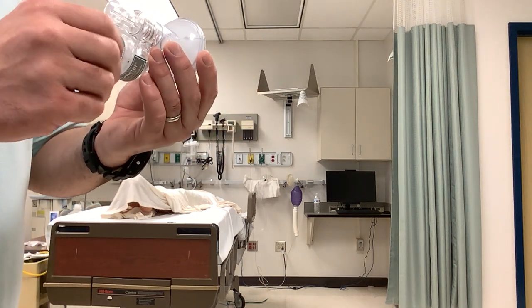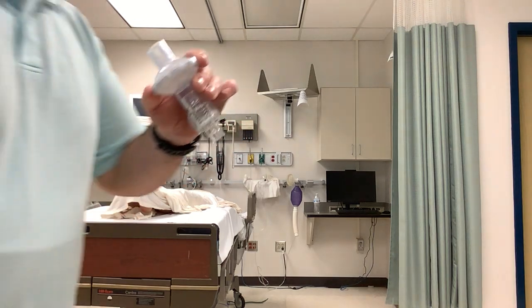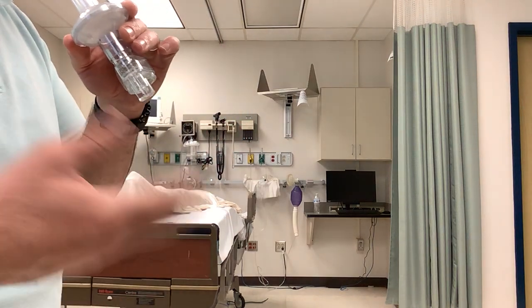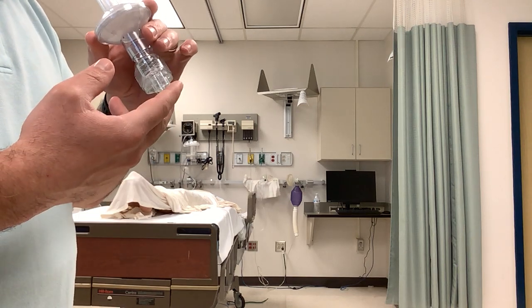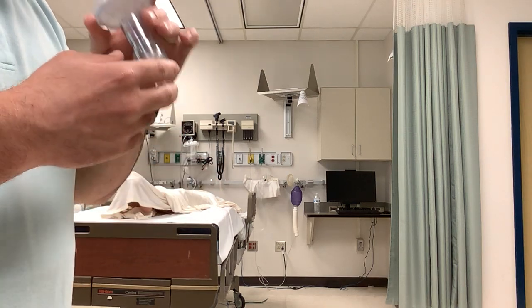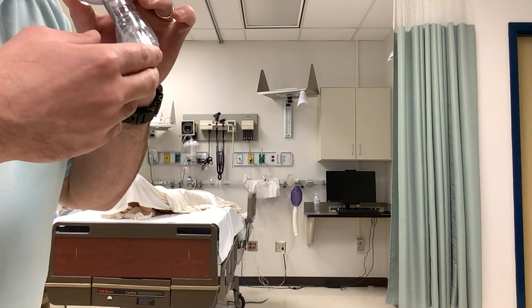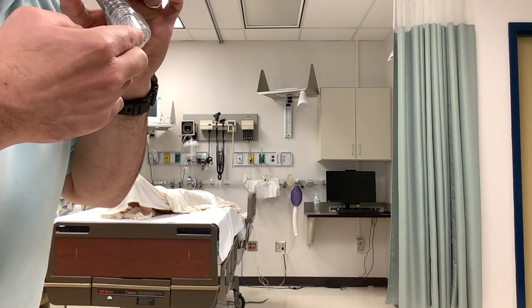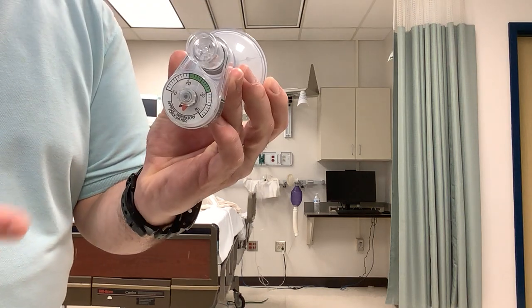When doing this particular reading, I'm going to have my patient take a few breaths in — they'll breathe in and out normally. Then when I want them to, I'll tell them to take in a nice strong breath as hard as they can, and then I can look at the results. So: breathe in and out normally, then a strong deep breath in as big as you can.